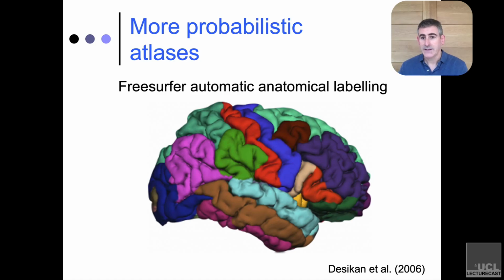So if you have the time and the computational power to download and install FreeSurfer and use it to look at the anatomy of each of your individuals, then that is a very, very powerful tool, and it will help you to learn some of the anatomical areas. It doesn't tell you exactly how it did it, but it's still a great tool.